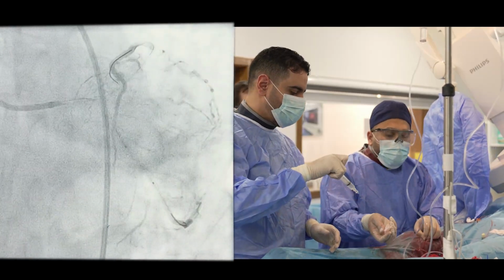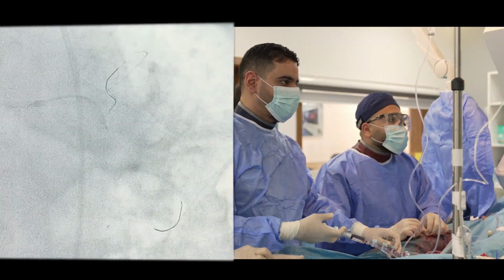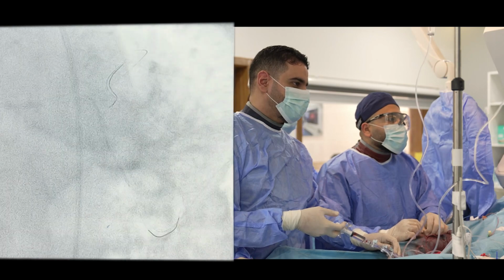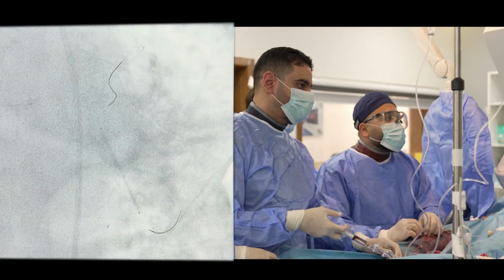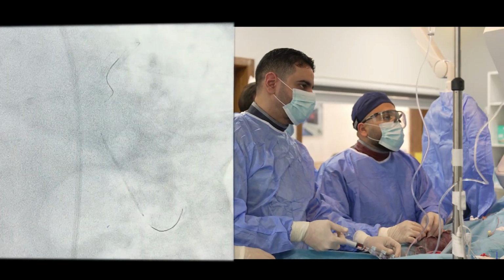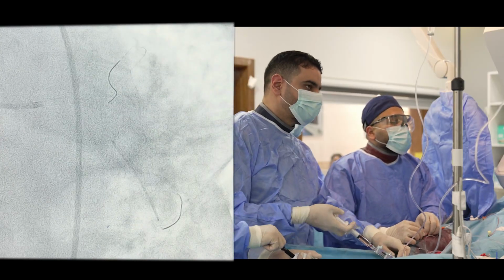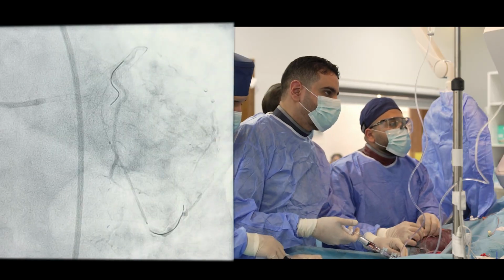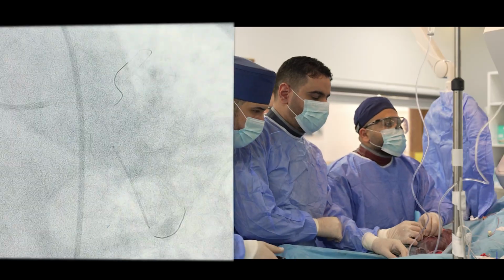Go caudal again. Okay. Go distal. I think it's okay. It's okay. More. Go more. Cut. Test. Okay, let's do angio. Okay. Yeah, that's good. Perfect. Inflate. No, good now. 12.